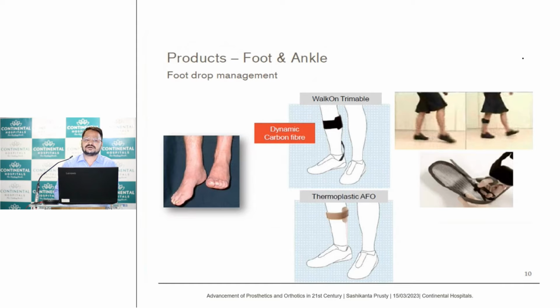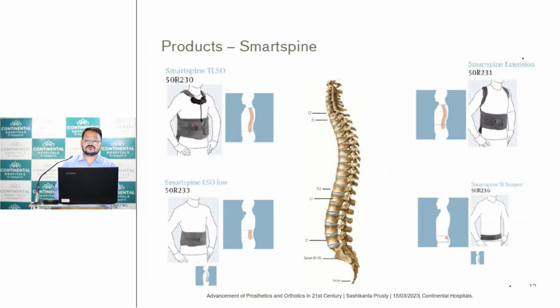Spine, I already discussed. These are some of the specific designs available. For anterior support, we give some sternal support to control the hyperextension. Beyond this, we have cases of scoliosis, and in those conditions we have to go with customized braces. Basically, we have to analyze the Cobb angle, then see whether it is a flexible deformity or a fixed deformity, and whether, because of that deformity, there is any secondary deformity. Then we plan the design and the force action.